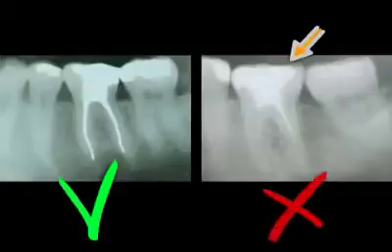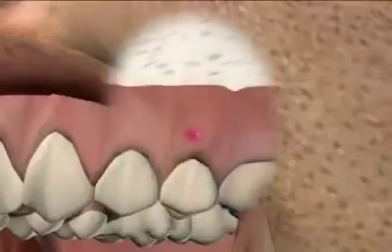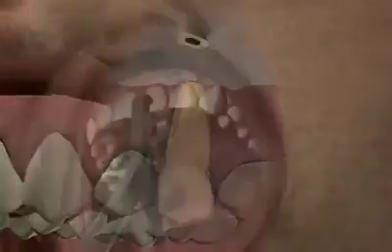On the right, you see an example of a tooth with a badly executed root canal. The root in the front was not filled at all, while the rear root was only filled halfway. Such teeth can cause trouble even after many years, and can lead to a variety of complications, such as an acute bone infection or an abscess. In this case, a root end resection and/or a tooth extraction would be necessary.